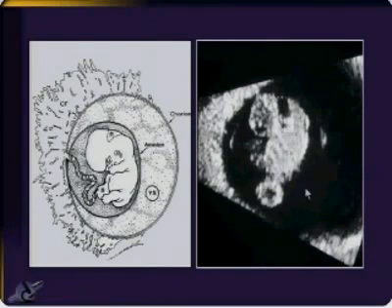I have this flipped so it matches the diagram, but we can start seeing normal development. We see the lucency in the back of the head, which is the rhombencephalon. We see physiologic gut herniation here. This isn't a little sacrococcygeal teratoma. That's a yolk sac that's been jettisoned at this point. And you can see the amnion out there.